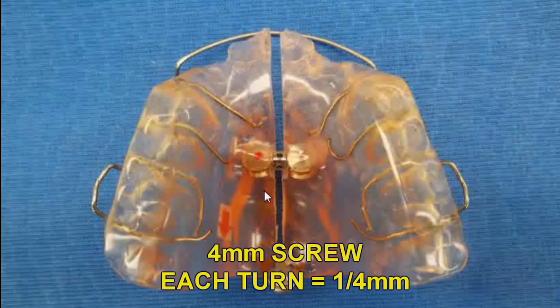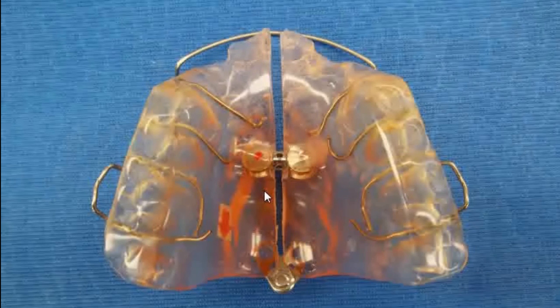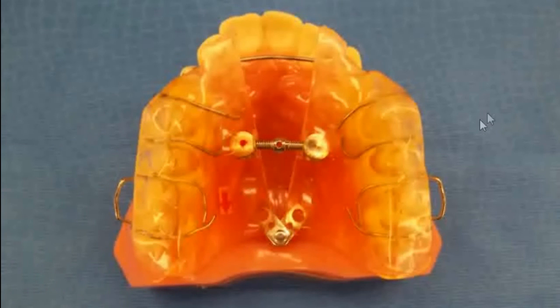The turning schedule for this appliance is the same. One turn twice a week or one turn once a week for adults. It will take about 2 to 3 months to fully activate the appliance. If you need additional expansion, a second appliance may be needed. Once the expansion is completed, you'll need to retain the expansion for 4 to 6 months, just like the Schwartz appliance.